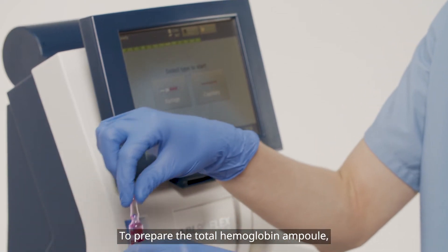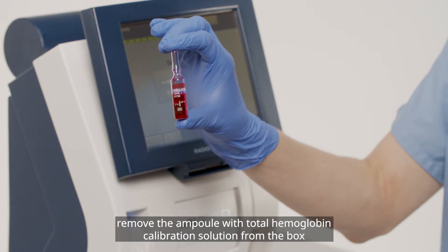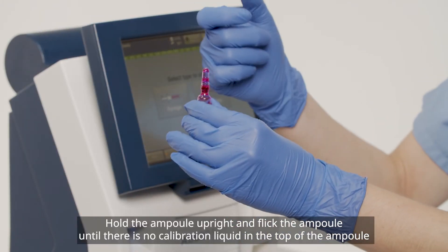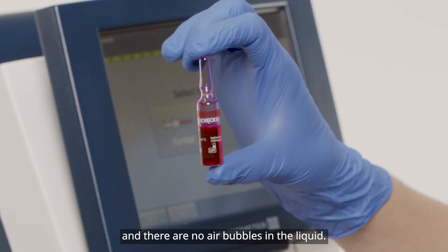To prepare the total hemoglobin ampoule, remove the ampoule with total hemoglobin calibration solution from the box and shake the ampoule for 15 seconds. Hold the ampoule upright and flick the ampoule until there is no calibration liquid in the top of the ampoule and there are no air bubbles in the liquid.